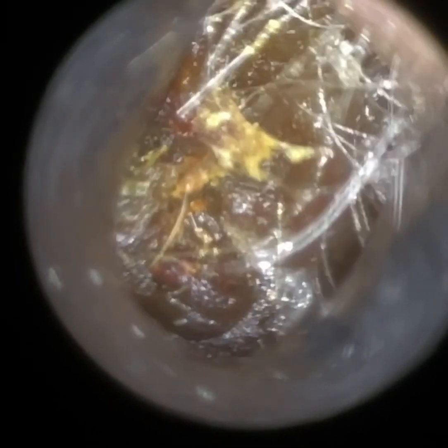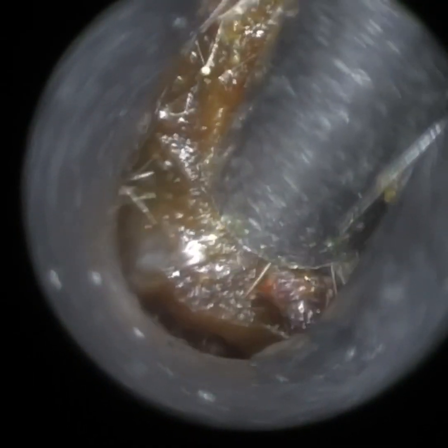With the Waxscope, it's a bit like when you're using loops or an ENT microscope — you have a speculum that dilates the ear canal and you can fully visualize the contents of the ear. Instead of holding the speculum in place using your non-dominant hand as you would with loops or an ENT microscope, the speculum here is attached to the end of the Waxscope — it's like a clip-on. We have an open working channel and a slit at the top as well, which enables the instrument to be inserted into the ear at a higher angle. That helps improve the optics inside the ear, because it's not obscuring the whole view, and it also provides more maneuverability.